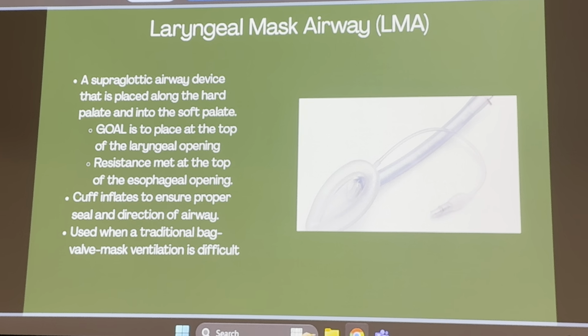Again, these paramedics, people in the field, are really trained to put these in pretty quickly, emergency type situation. They will use these sometimes in anesthesia as well. Real short-term fix, they may not fully intubate you. They'll put in an LMA and you may be able to ventilate this way while you're under sedation.